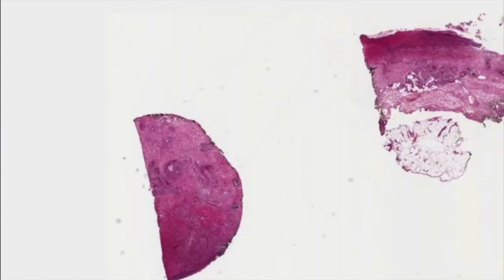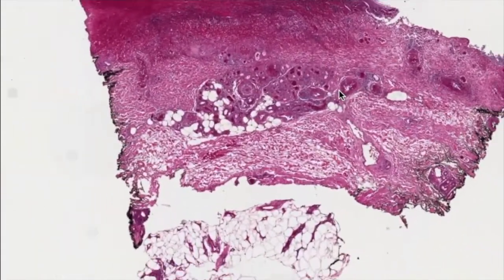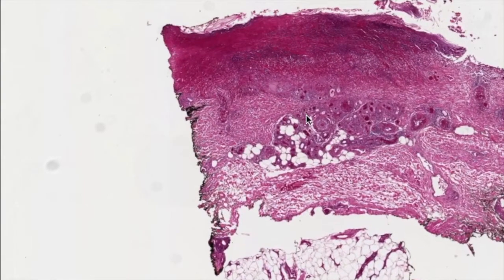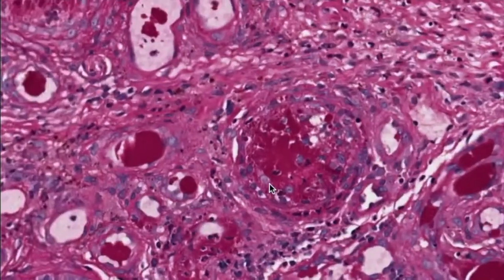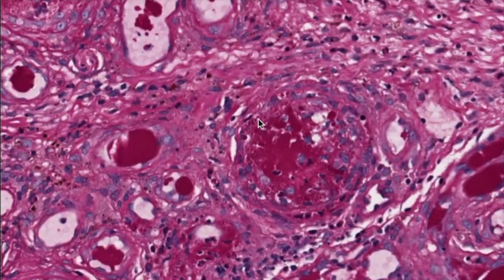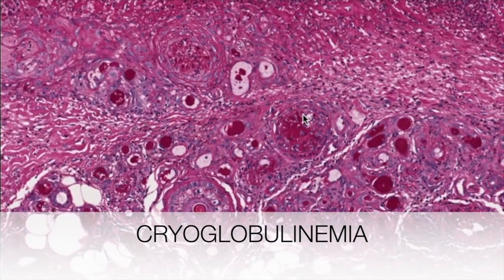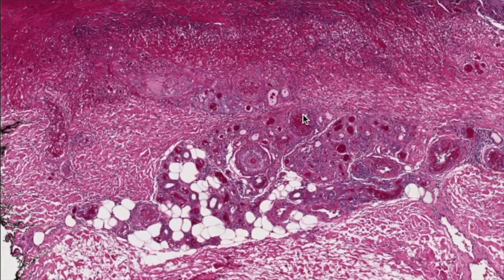Let's take another example. This is what we discussed earlier, and we said that the epidermis or the skin appears also necrotic and sloughed, and if you go on high power, you will see that the vessels are blocked with this very pinkish material. So this is a Cryoglobulinemia, and this is the mixed type. Another example of an overlap between the vascular occlusive group and also the vasculitis group.